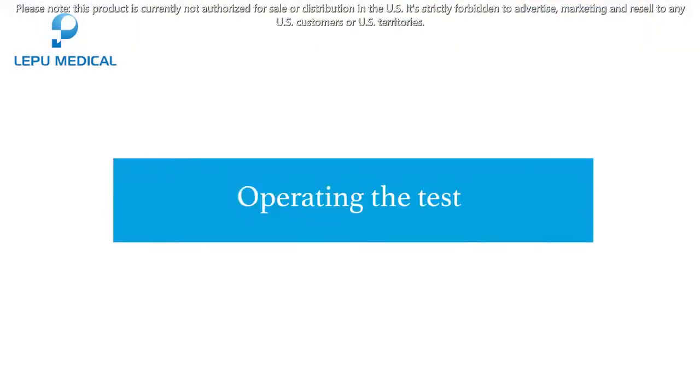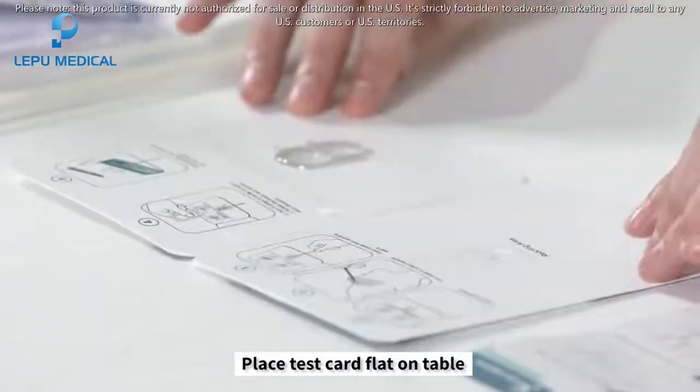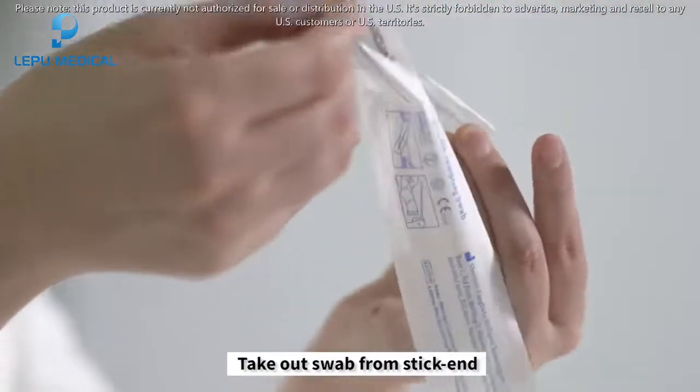Operating the test. Take out test card from outer package. Place test card flat on the table. Remove cover layer of adhesive. Take out swab from stick end.